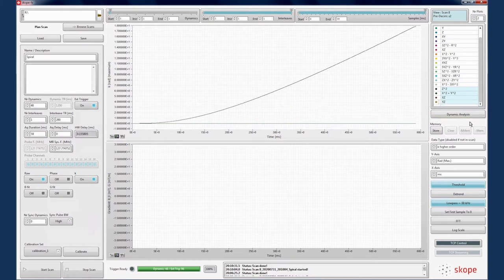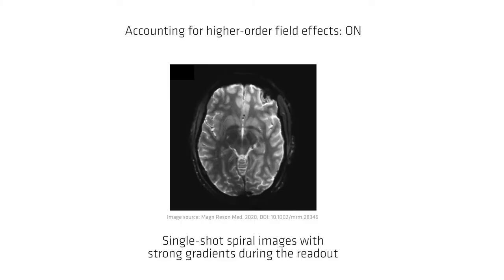Concomitant gradients are the spatially non-linear gradients which occur as a result of Maxwell's laws. ScopeFX measurements also include the concomitant fields. Shown is an example in which another imaging dataset was reconstructed, correcting for concomitant fields, then reconstructed again without that correction. Note the distortion that these fields cause in the image.